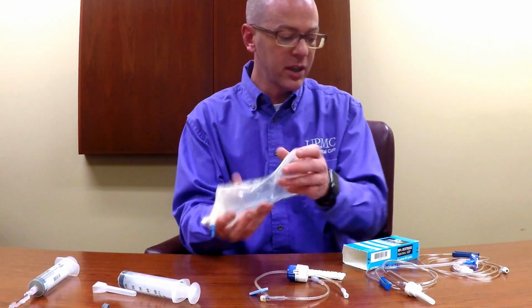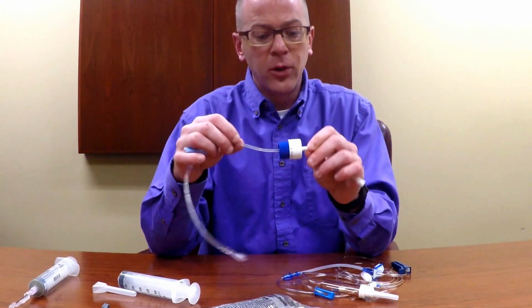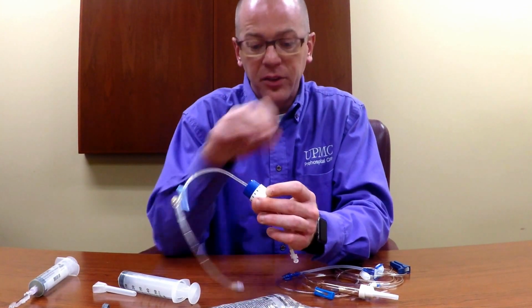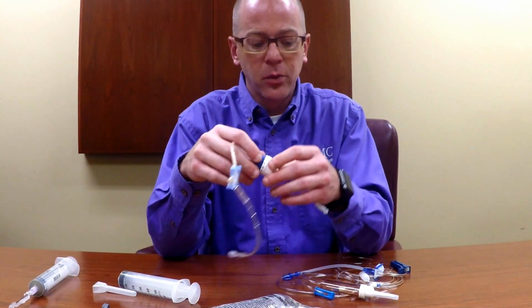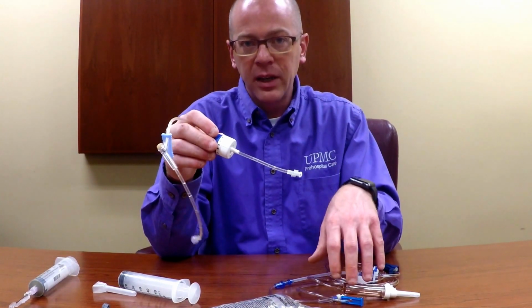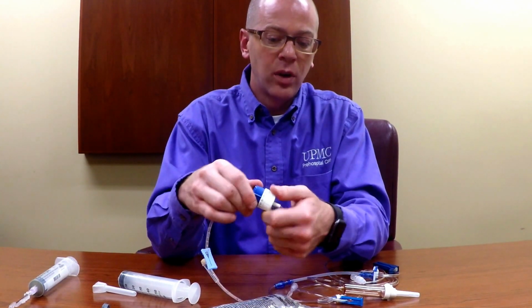And now I'm going to collect a 60 drop infusion set as well as a dial-a-flow or flow regulator device. This device may be somewhat new to you. You'll notice that it has some numeric scoring along the outside. This is measuring cc's per hour that the device is going to allow to pass through. In those instances where we're using a 60-drop administration set, cc's per hour and drops per minute are the same numeric value.